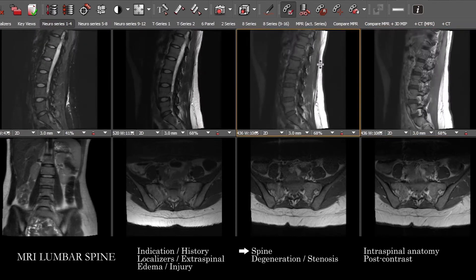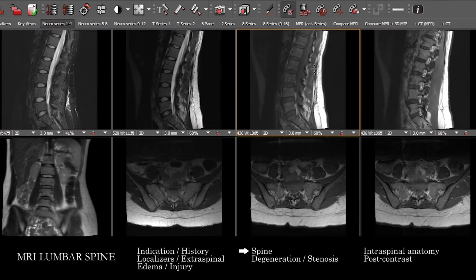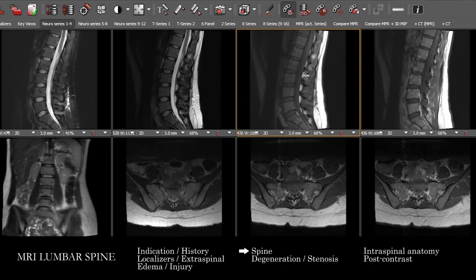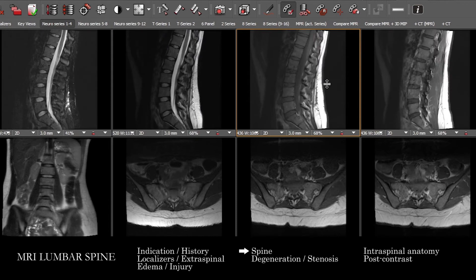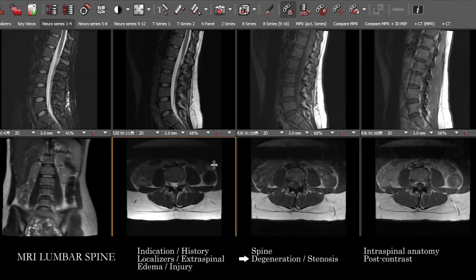So you're looking at bone marrow signal and disc signal similarly. Once you have a sense of alignment, the morphology of the vertebrae, its various components, and the signal — what we're going to do is take a look at how any degenerative or disc abnormality impacts the spinal canal and nerve foramina.